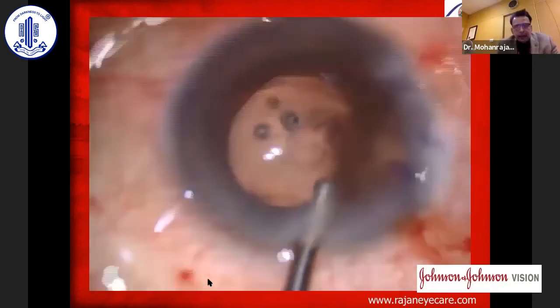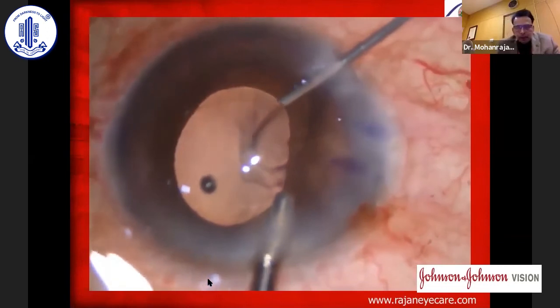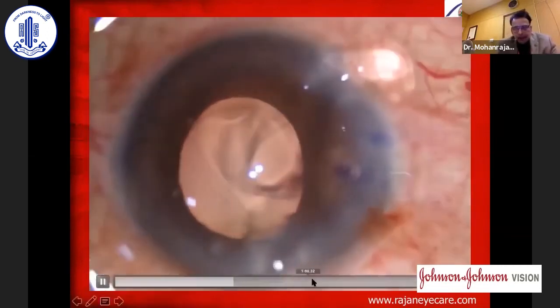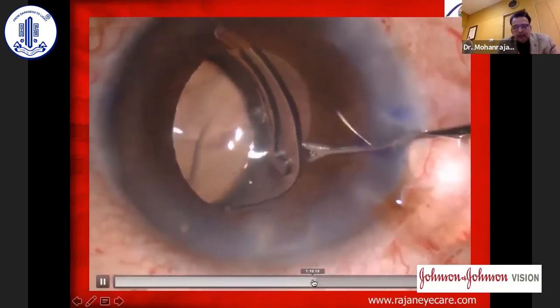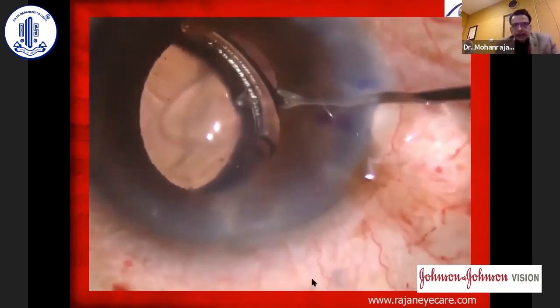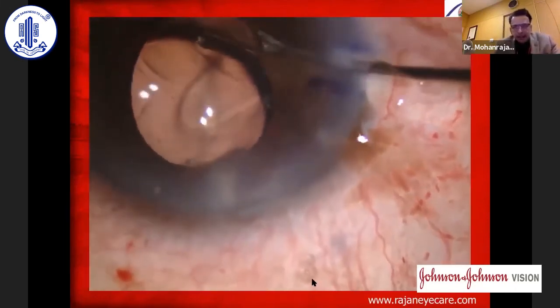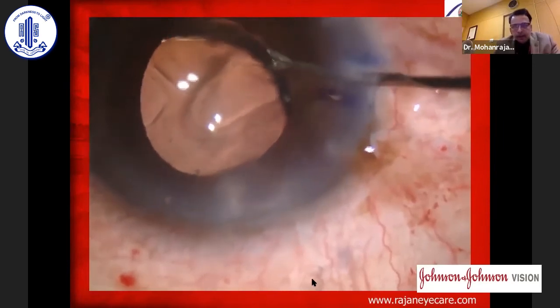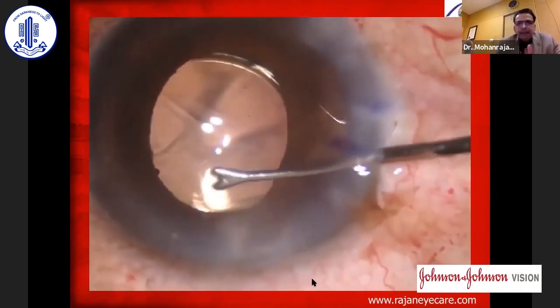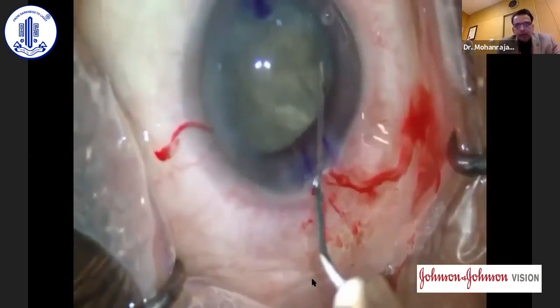making sure that the anterior hyaloid is not ruptured. And you can see that I'm using an anterior chamber maintainer, introducing visco every time I come out of the eye, and then going ahead and putting a Technis toric lens in this case. Fortunately for me, I was able to just tuck the lens inside, at the 180-degree axis, the same as the location of the incision, and the patient did very well. But with a large PC tear, my sincere take-home message is not to put this lens.